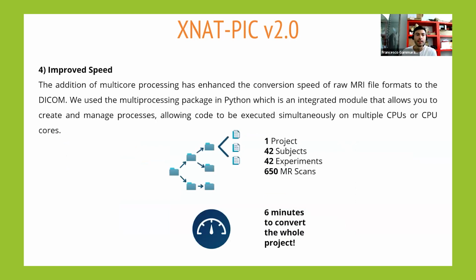And we have added multi-core processing for improving the speed of the converter. For example, for one project that contains 42 subjects and 42 experiments that are more or less 650 MRI scans, it takes 6 minutes to convert the entire project.